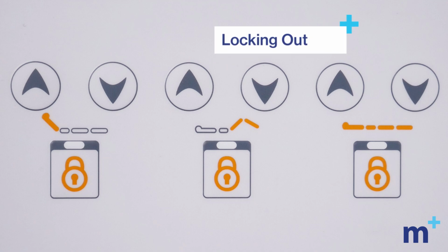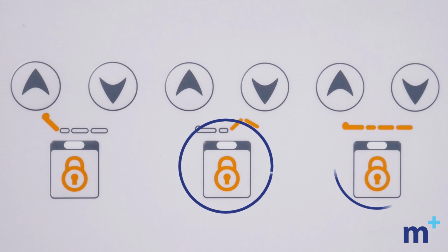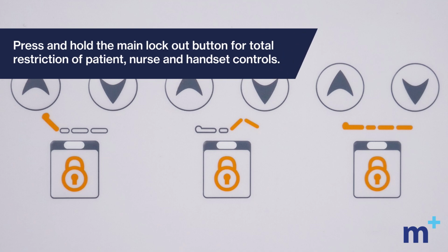Functions can be locked out to prevent patient use. Use the individual lockup button under each function on the Caregiver Control panel. A red light will illuminate to indicate the function is now locked. To unlock, simply press and hold the lockout button again.